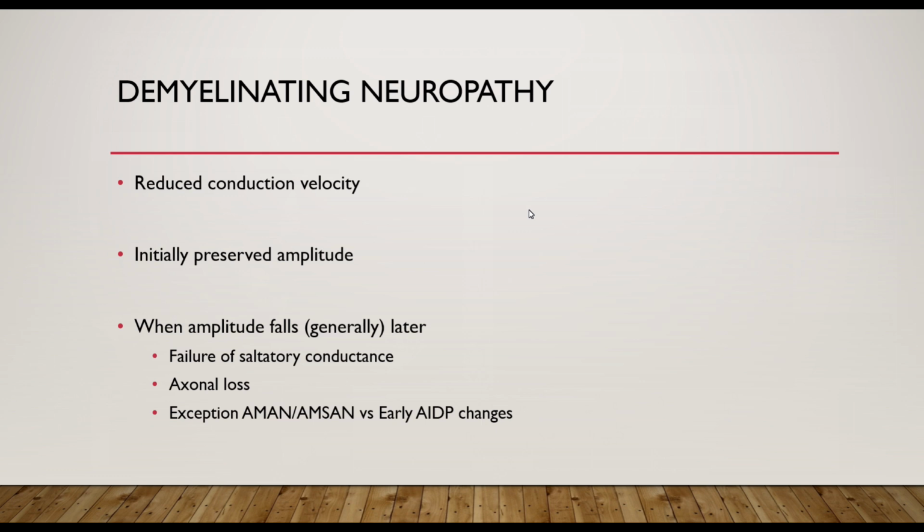And for some of those patients, it can actually just be a very early presentation of the Guillain-Barré. And so it's worthwhile making sure that one repeats the studies, usually about 2 weeks later, just to double check and being sure that it really was an AMAN or an AMSAN and it wasn't a Guillain-Barré, because then it can be far more positive for a patient's outcome.